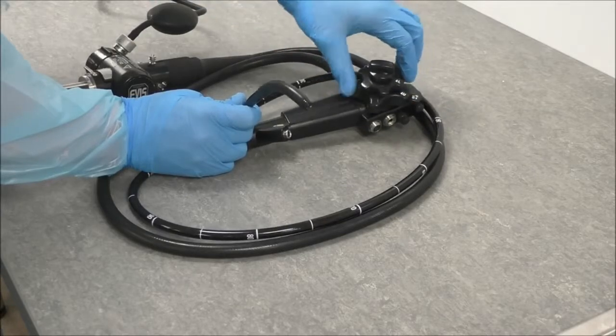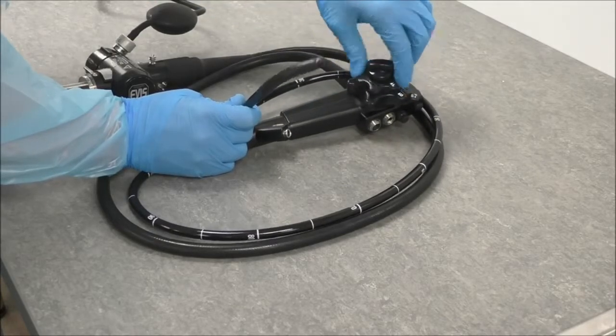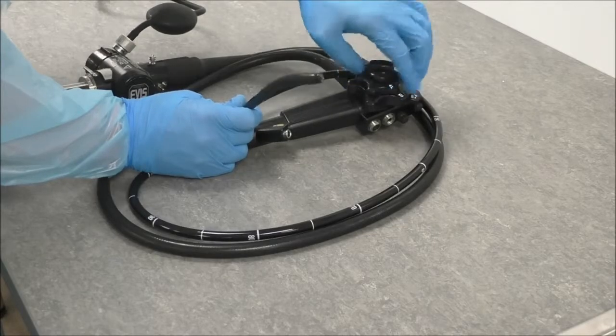Angulate the bending section to all extremities. This will emphasize a leak in the bending section.